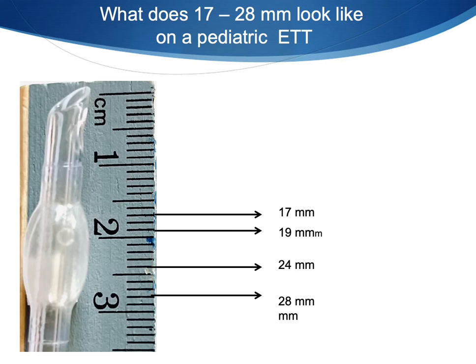Same thought if you extend the head. As you know, the tube follows the nose. So if you extend the baby's head or the child's head, the tube can move any little distance like that, and can also cause the endotracheal tube to become extubated.